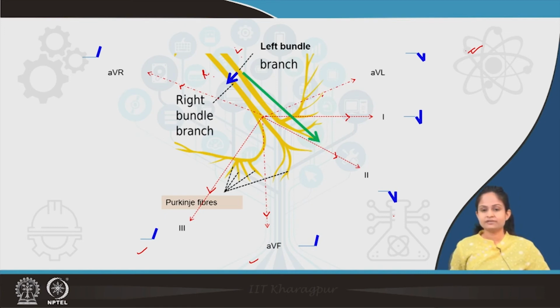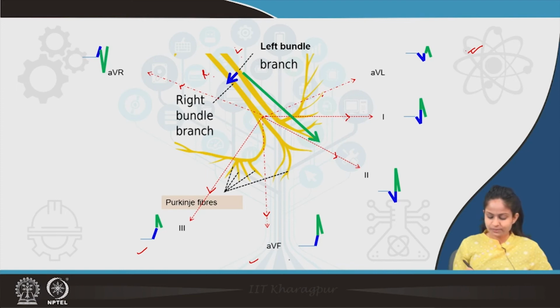The next ventricular depolarization is the maximum ventricular vector, which we get towards the lower and lateral side, and according to this vector, what is the R wave configuration we get? Whichever leads are present towards this vector or wave of depolarization give positive waves.